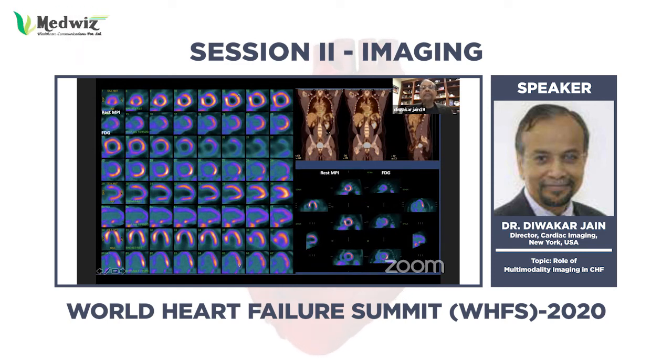These are the MIP images, fused PET-CT images. We can see the uptake in the heart, and also there is an uptake in the calcified lymph nodes. So there was extracardiac sarcoidosis as well, involving multiple lymph nodes as well as lungs, apart from the cardiac uptake. So this patient, the biopsy showed the patient has cardiac sarcoidosis.